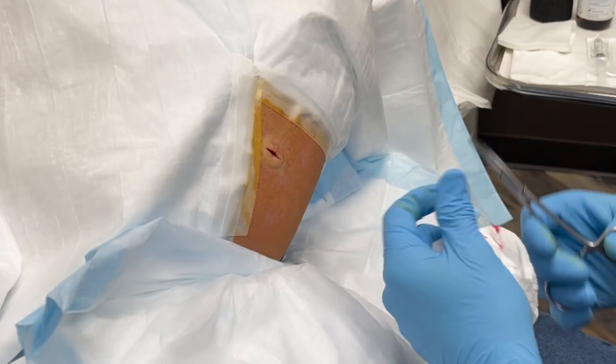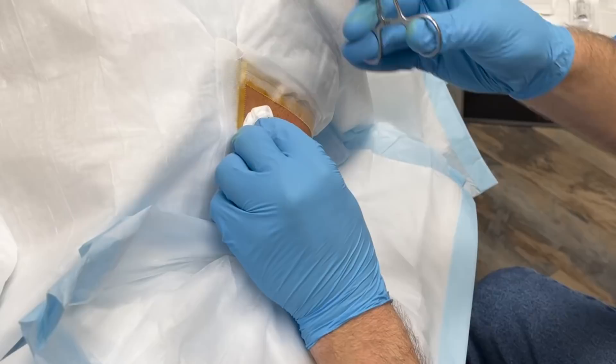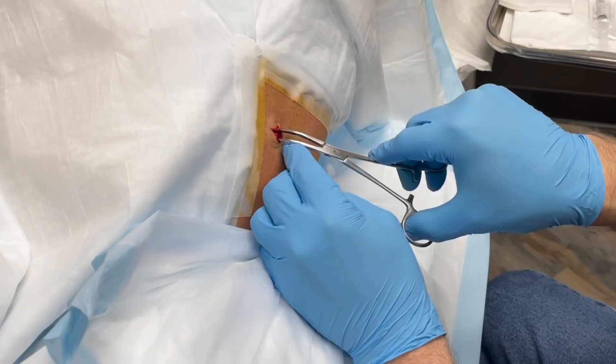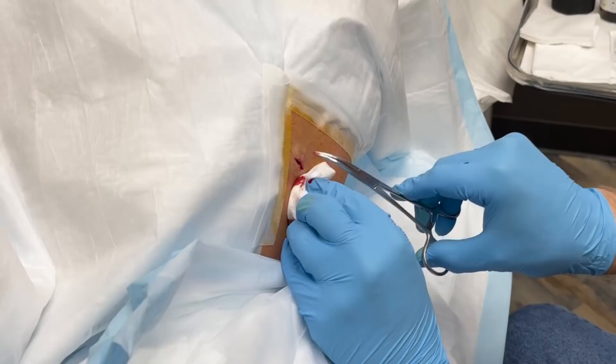And we'll use the hemostats — I call them hemostats. It's a surgical tool, looks like this. Kind of curved. We're going to open up a little bit here, and we can already see some of the cystic material here. That's very good because that means we got a pretty good shot of getting this sack.